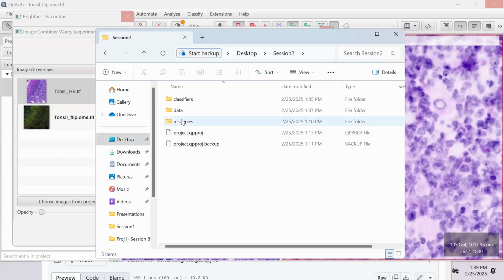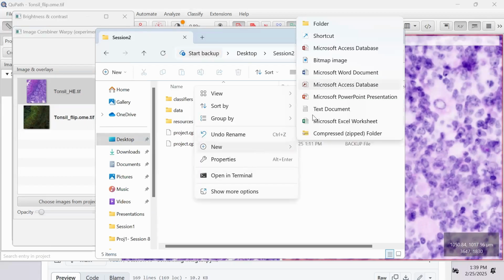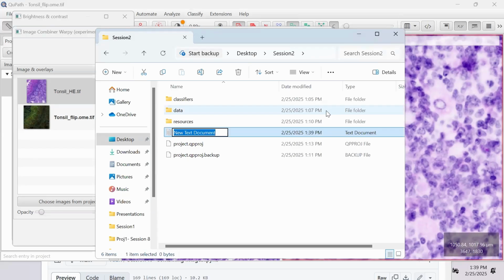Can I have the microphone because this is actually important? Importantly, this is not 2 consecutive slides. This is the same slide. We did the fluorescence, and then we did H&E on top. If you're doing 2 consecutive slides, you will never match nuclei to nuclei like that. It's just impossible.